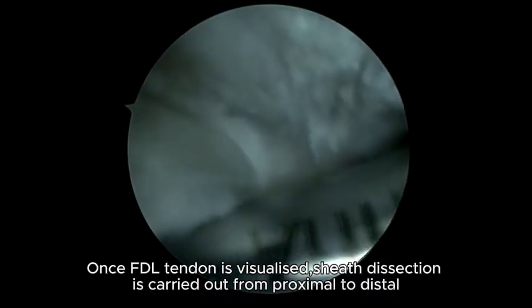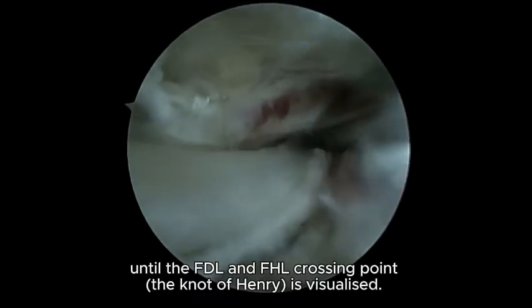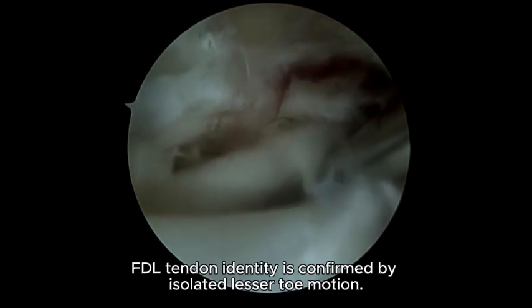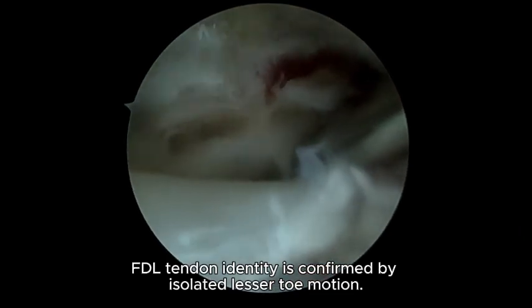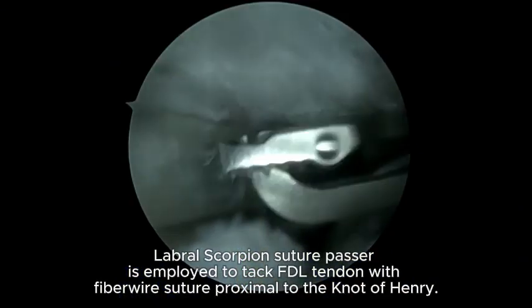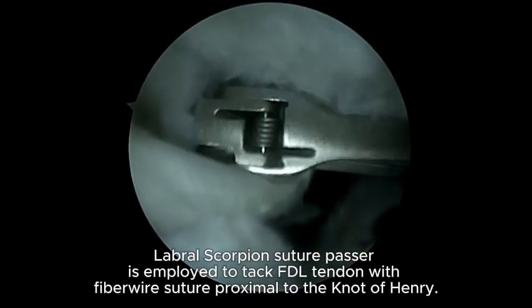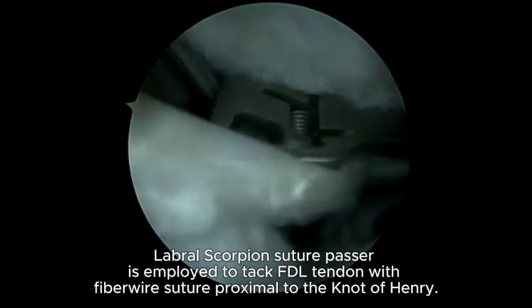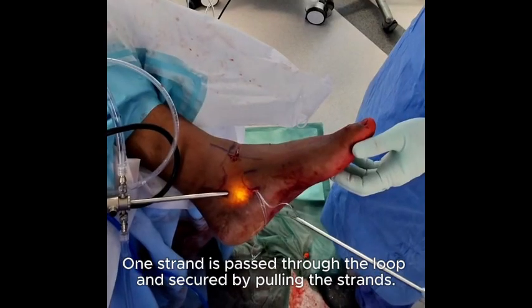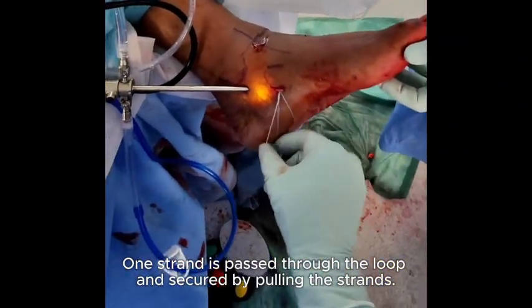Once FDL tendon is visualized, sheath dissection is carried out from proximal to distal until the FDL and FHL crossing point, known as the knot of Henry, is visualized. FDL tendon identity is confirmed by isolated lesser toe motion. Labral scorpion arthroscopic suture passer is employed to tack FDL tendon with the fiber wire suture proximal to the knot of Henry. One strand is passed through the loop and secured by pulling both strands.